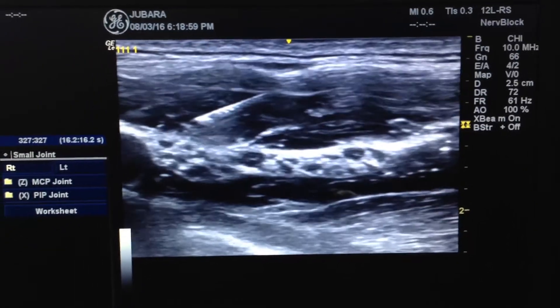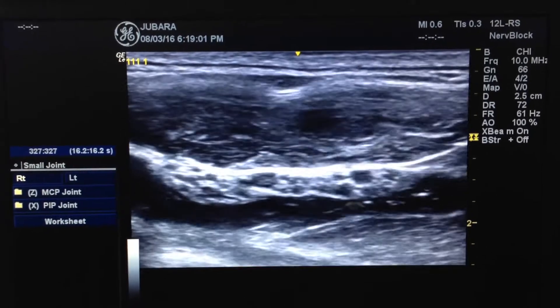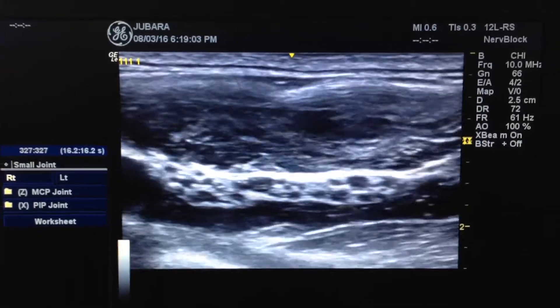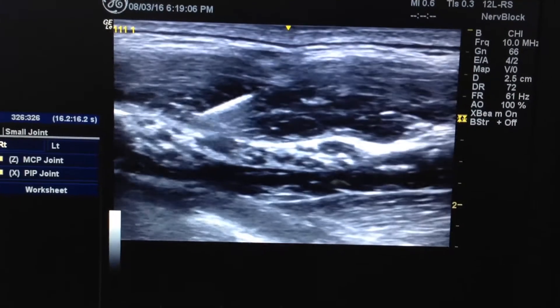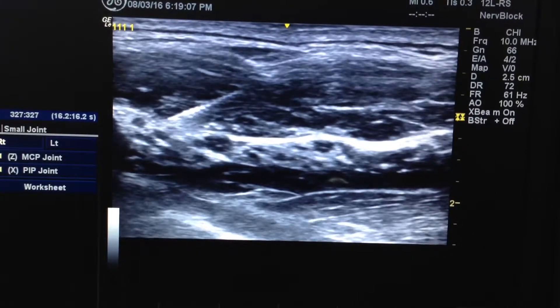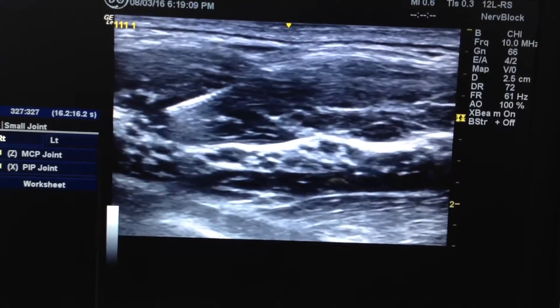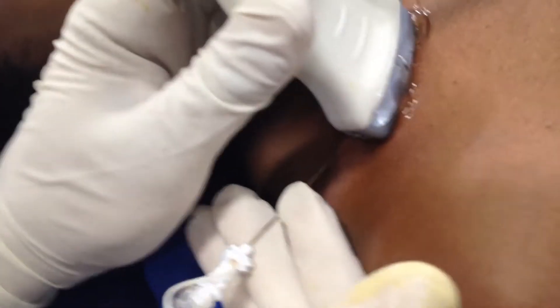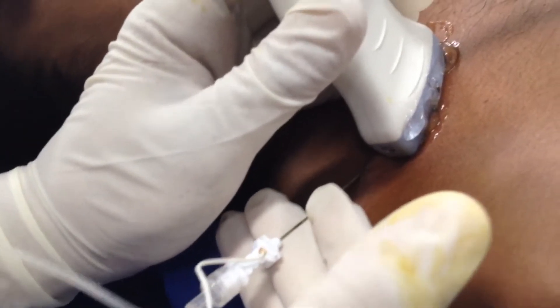Now this is the brachial plexus block — spread, eject. Okay, finished.